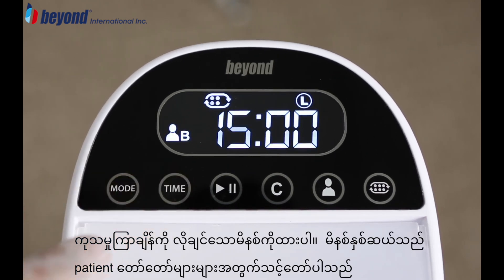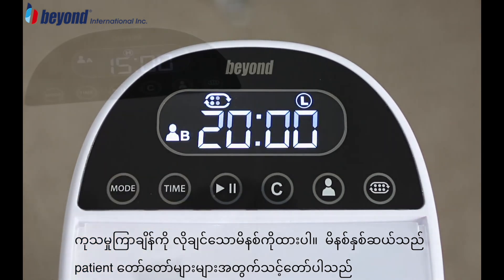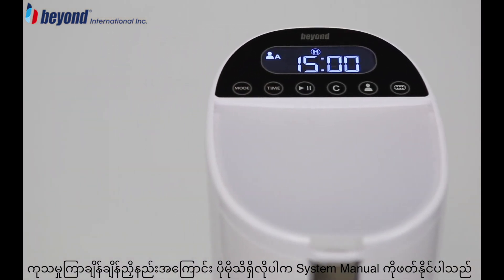Adjust the treatment time to the desired number of minutes. 20 minutes is the recommended cycle length for most clients. For more information on adjusting the treatment time, refer to your system manual.